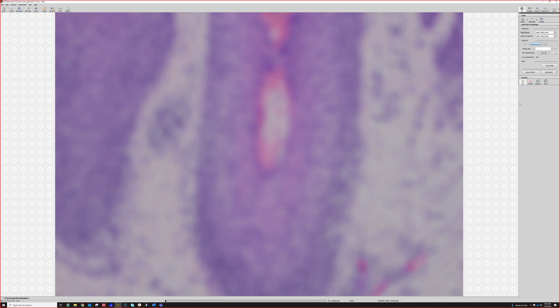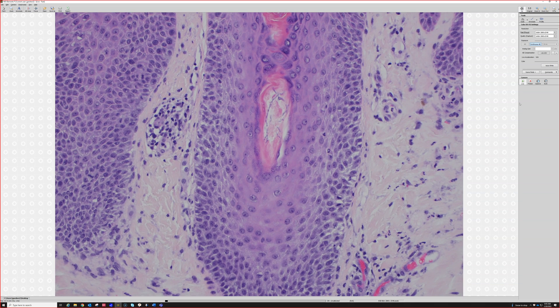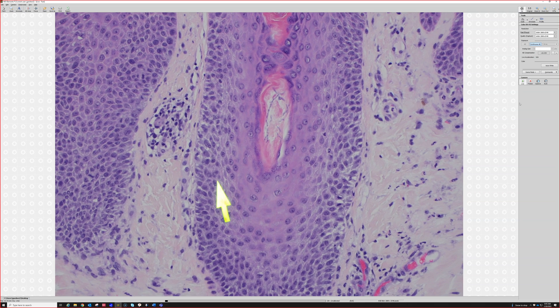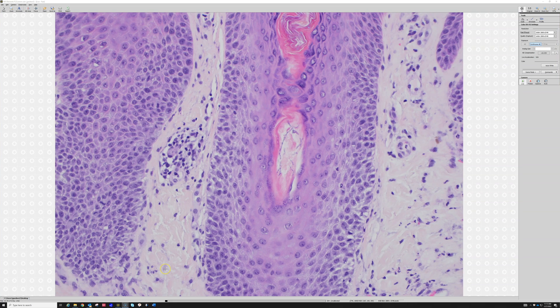And sometimes there's like no inflammation — this follicle has spongiosis but no inflammation. So there's the fungus in the follicle.